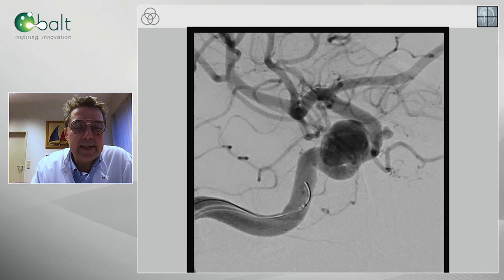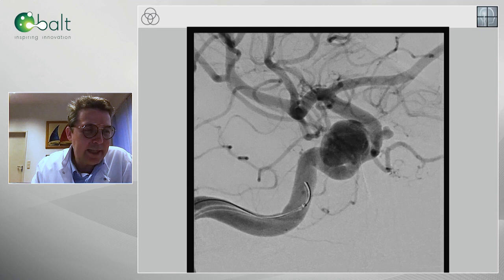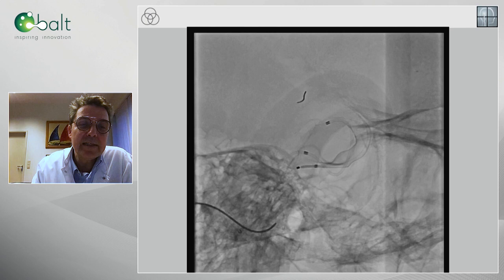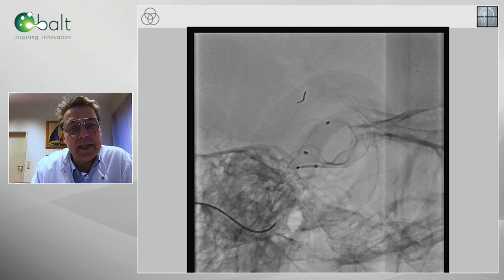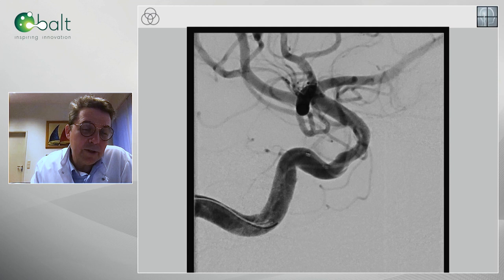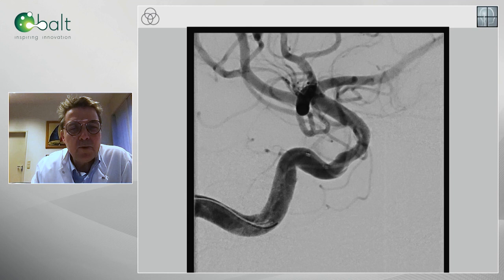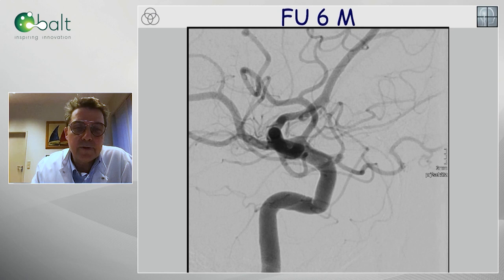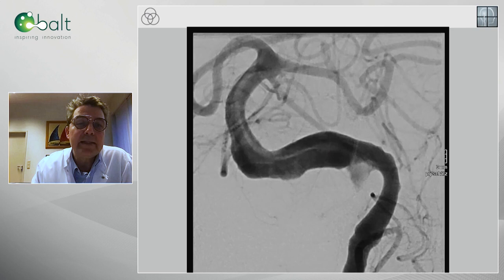Now some examples with the Silk Vista adult going through the 21 microcatheter, where we intended to bring a catheter, jail a catheter, and place the Silk. Because of the nice conformability and the ability to shoulder the device and to increase the mesh density, I was quite surprised to see that after placement of the first flow diverter, there was absolutely no flow left. Is there still a need to continue to place some coils here? Probably no, it does not make sense. Just took the microcatheter out, and at six months this aneurysm is cured, which is confirmed on MR where it completely disappeared.